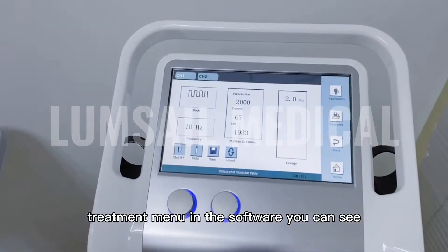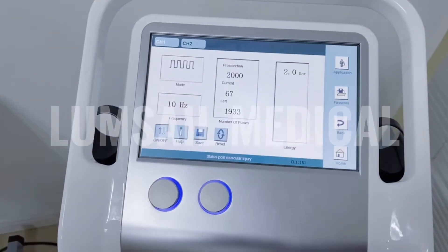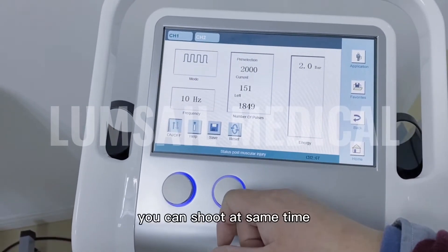On the treatment menu, you can select channel 1 or channel 2. With channel 1, you can set the parameters freely and shoot at the same time.